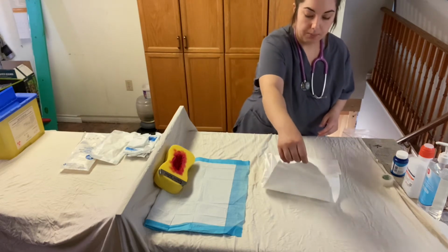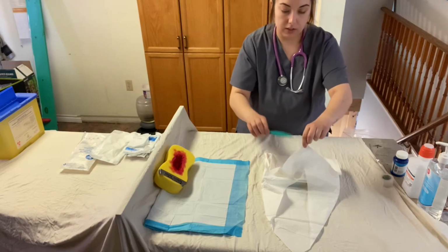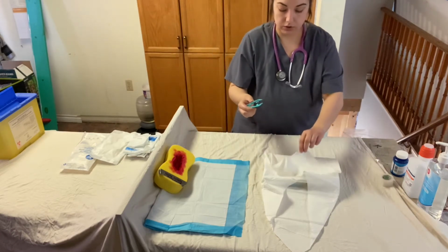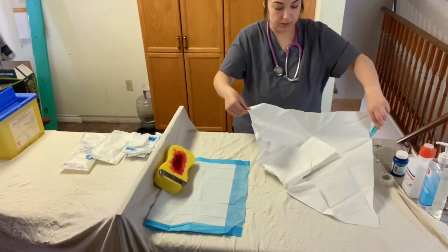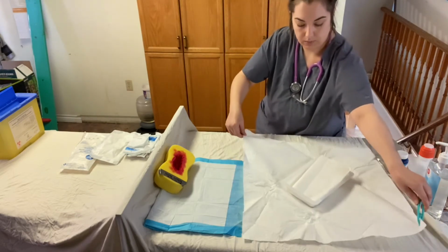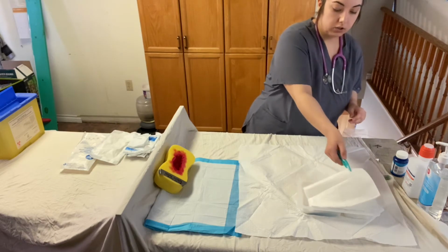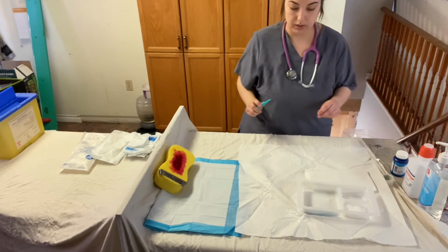I'm going to open it flap away from me to maintain a sterile environment. I'm then going to grab the handle of my sterile forceps. I'm not going to touch the tweezer end, and I'm going to use these to slowly place my sterile field into the correct position that I would like it for the procedure. So what's comfortable for me, perfect, is there. I'm going to use this to adjust my tray, and I'm going to take out this white drape sheet that's inside that I could use to extend my sterile field, but I don't feel the need to currently.